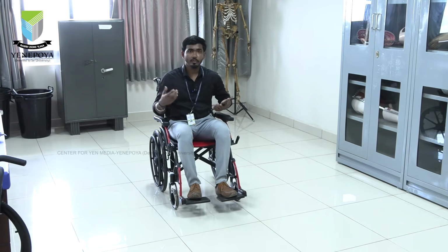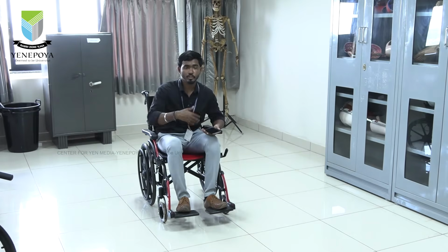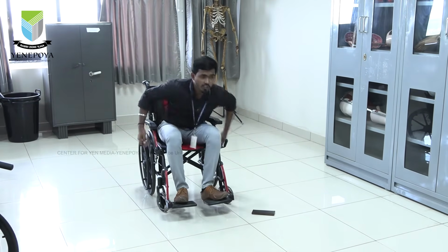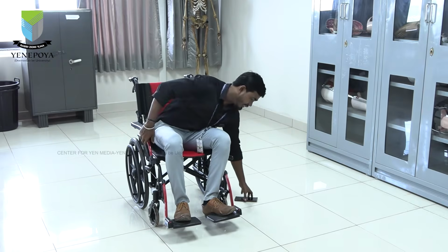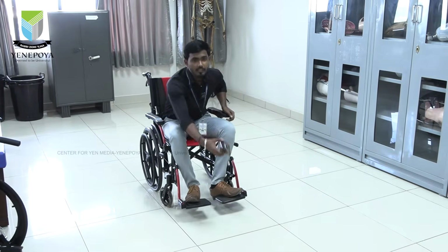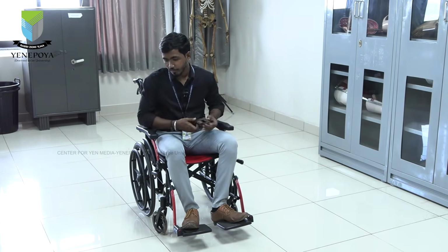The next of the main skills is for spinal cord injury patients, mostly spinal cord injury patients are going to do this one. If something is falling down, what are the skills we have to do? The person has to go to this side and put the brake, then we have to teach sideways reaching. Not only sideways, if it falls in front also, the person has to bend and take it forward. For this the person needs more stability in their trunk control. So this is one of the main factors.